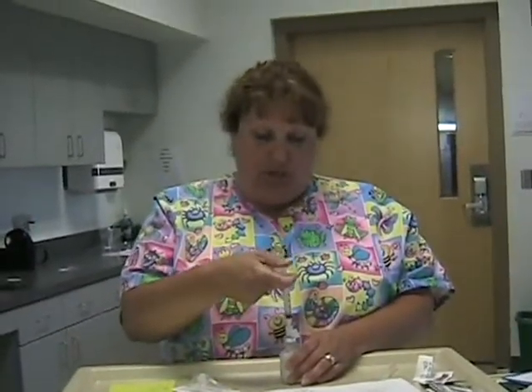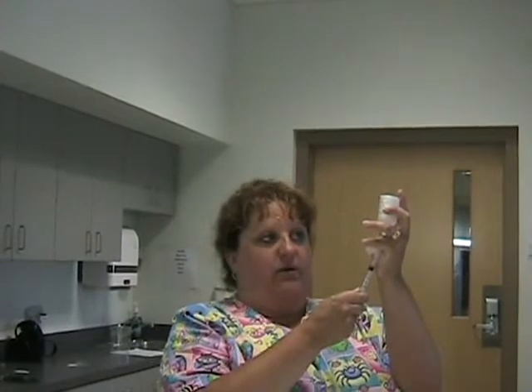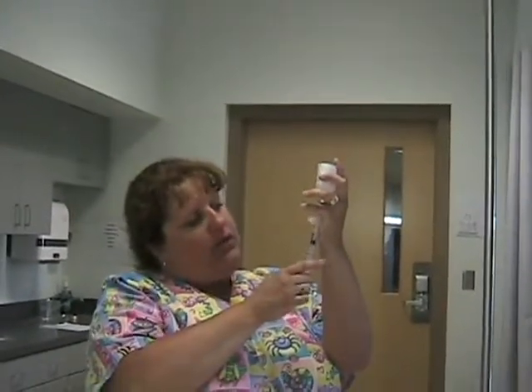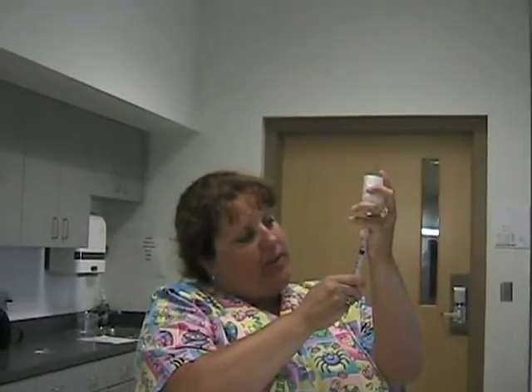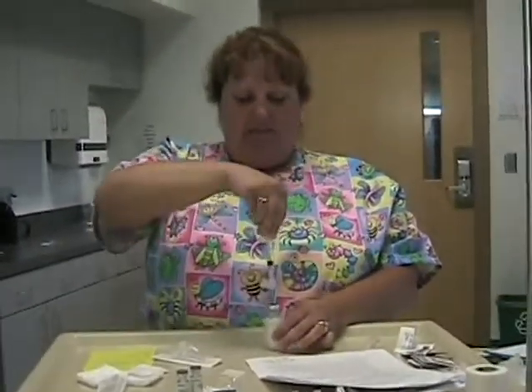I'm going to go ahead, insert my syringe, go ahead and plunge my air, turn the vial over, bring the bevel of my needle down, go ahead and draw up 1/2, go a little bit beyond, and go ahead and push the air bubble out. Go up to the 1/2 ml, turn over the vial, and then go ahead and connect.